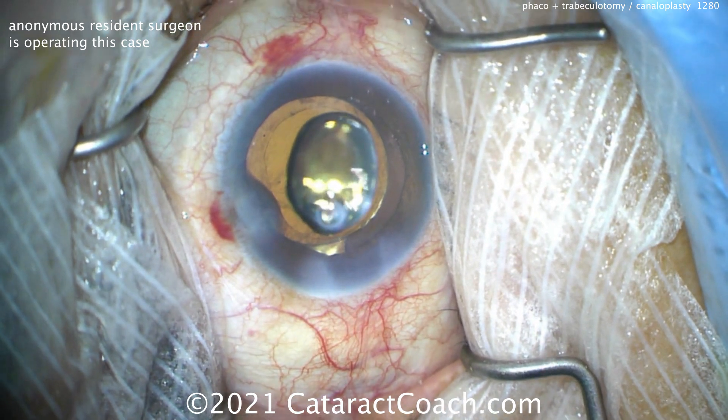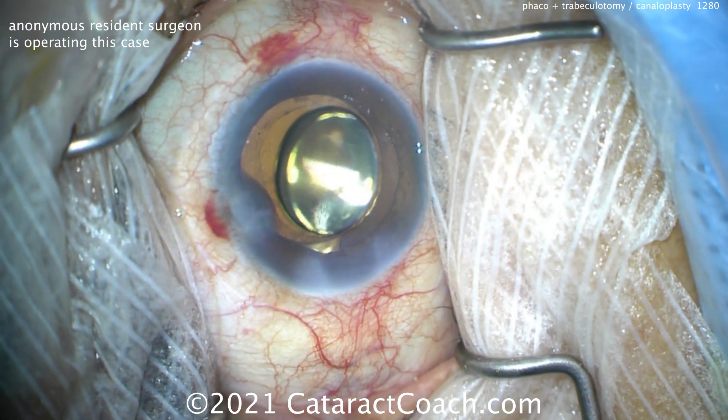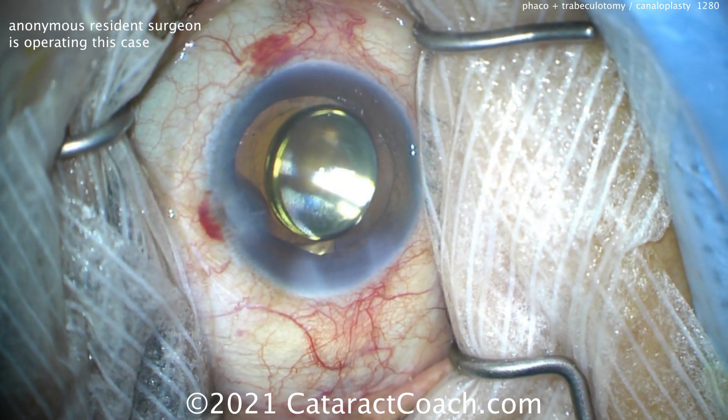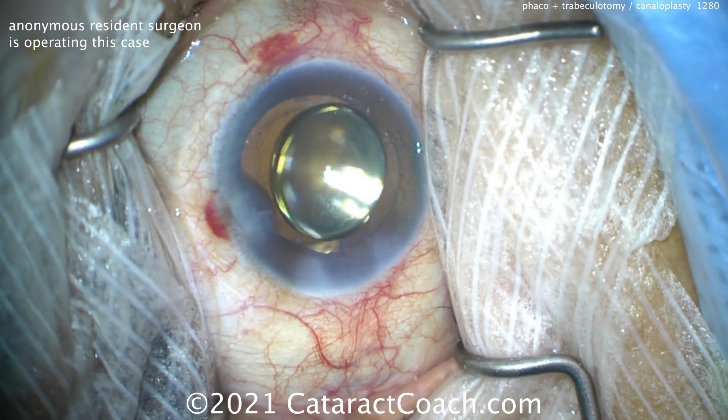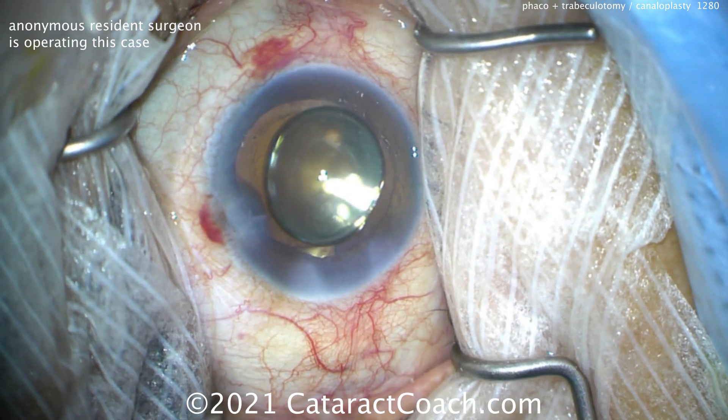So placing some dispersive viscoelastic on the cornea so we can mate the gonio prism to the cornea. Also important: avoid getting blood on the ocular surface. The heme there on the side is okay, but you don't want that blood mixing with the viscoelastic and causing your view to be compromised.